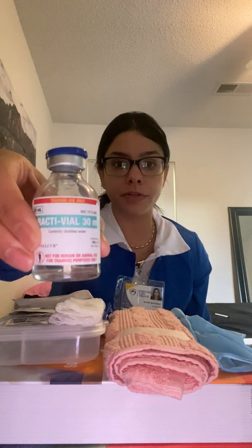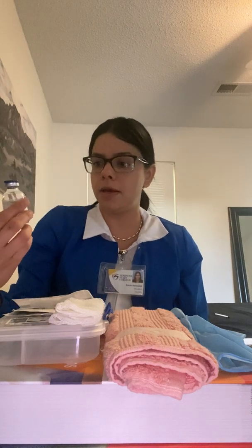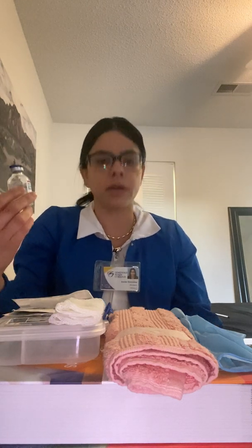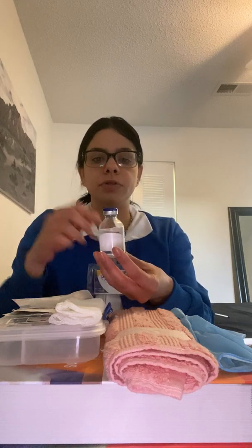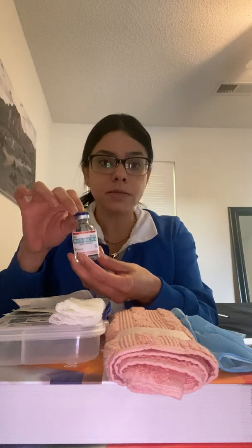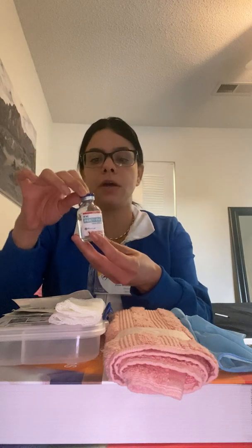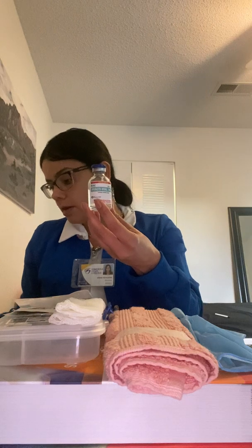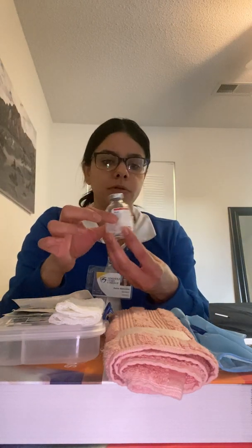Like I said, this is the vial that I am going to be using. The first thing I'm going to do is check the expiration date. Right now, this is not expired, okay, which is good. And then the next thing, for the purpose of this video, we're going to pretend this is the first time I'm opening this vial. Since this is the first time I'm opening the vial, I have to label it with the date, the time, and the initials, okay? I already have my label right here, so I am going to label it.